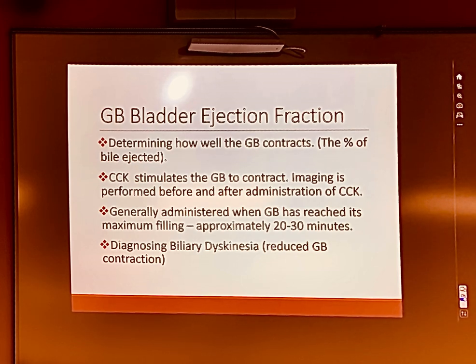That's what you're going to see. So now you may have a patient that comes in and their HepatoScan is normal. When you have a patient that has a normal HepatoScan, they may very well be normal. Everything's normal. The patient's pain is coming from something else, look someplace else.